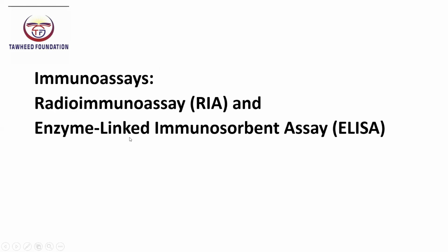So before we begin exploring the details of radioimmunoassays and enzyme-linked immunoassays, it is important to understand what immunoassays are and why they are so essential in modern biomedical science. An immunoassay is a biochemical test that exploits the specific binding between an antigen and its corresponding antibody to detect and measure substances in a biological sample.